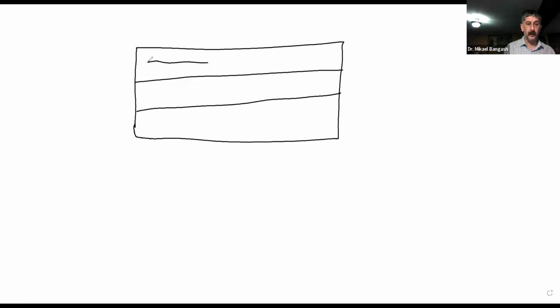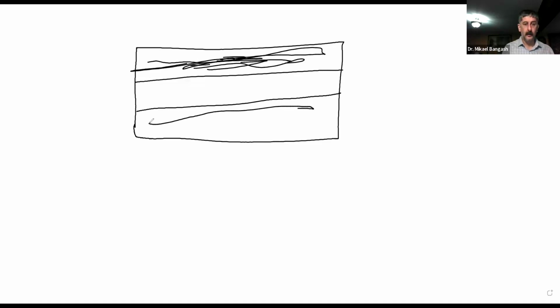So this means that's how it's going to appear. Then we turn on our color flow.